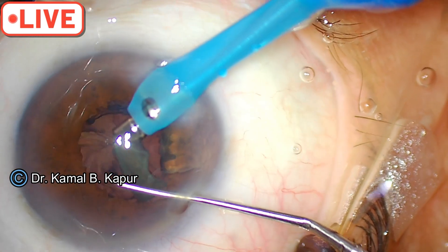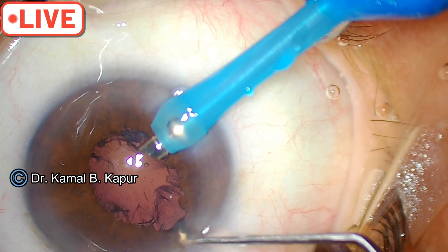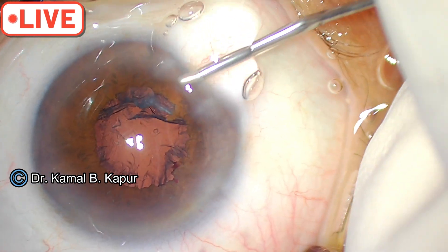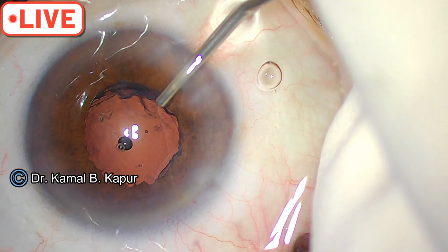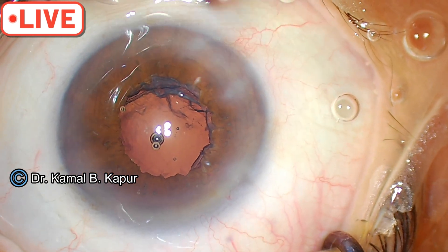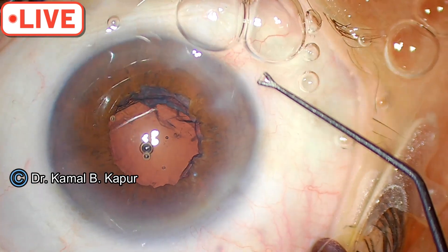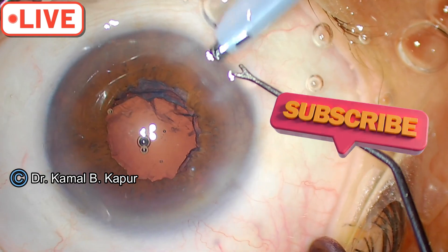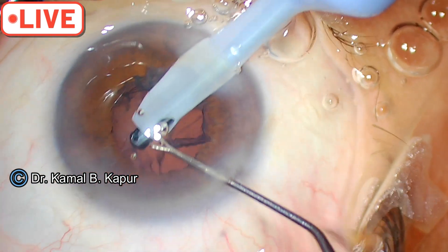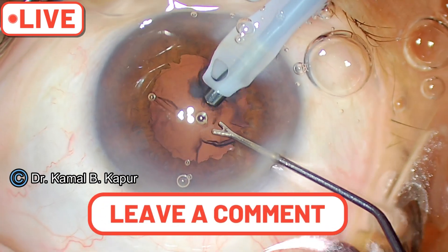Sometimes the iris sphincterotomy near the main wound can get extended because of excessive trauma of trying to come out of the wound. Again, before you go in with your instrument, you can see the pupil is nearly round — the sphincterotomy is not that disturbing for the patient. During irrigation-aspiration, remember don't end up pulling the sphincterotomy cut loose edge. If you do that, it will look very ugly the next morning because it will stand out like a large tongue.